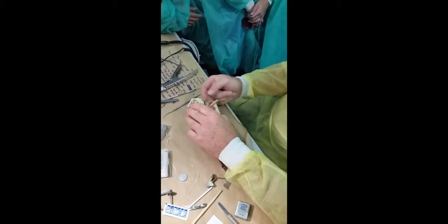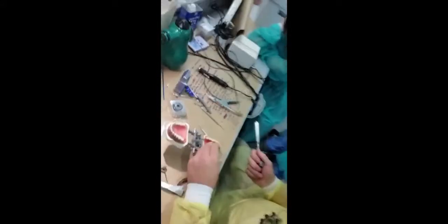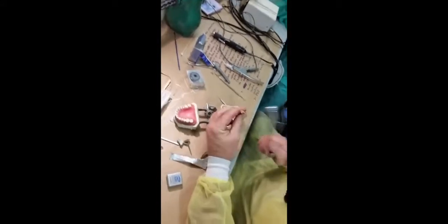You have to make sure the opposing tooth is down. You have to make sure you don't have sensitivity in the area. Alternatively, you can use one of the wood sticks, sharpen it down a little bit, put it on, and then take whatever the biggest instrument you have with a handle and put it in. These instruments are in the clinic in the mobile supply camp.